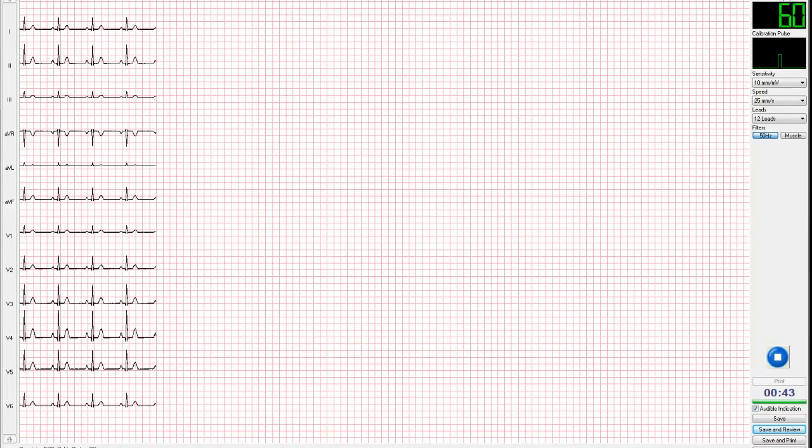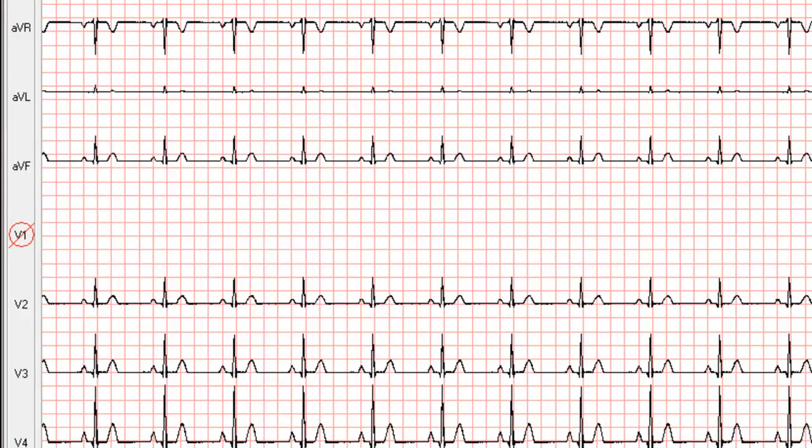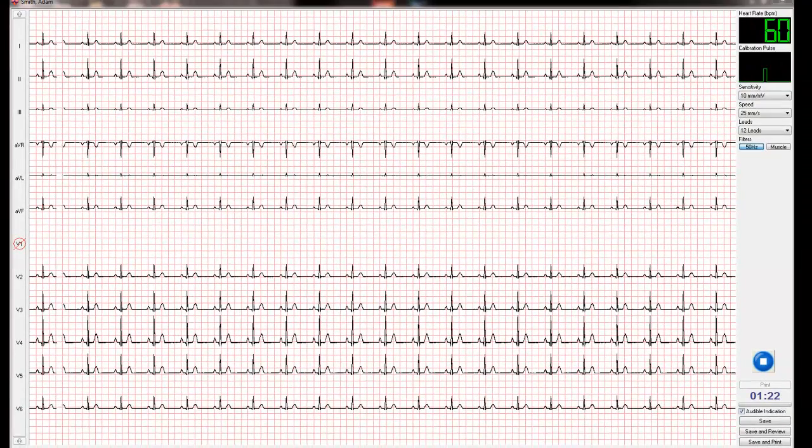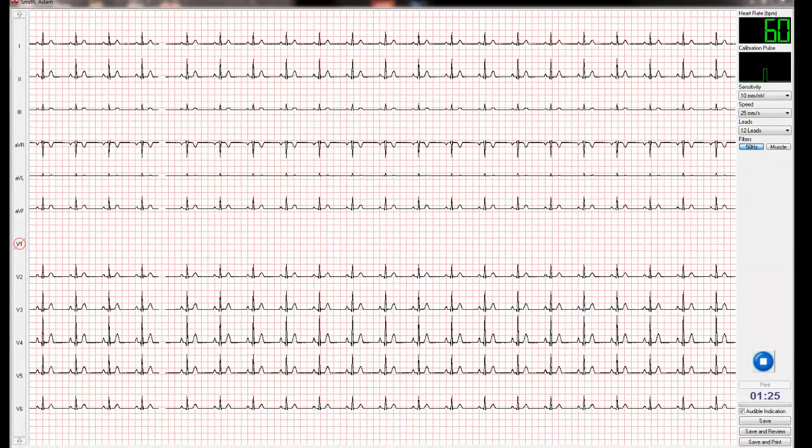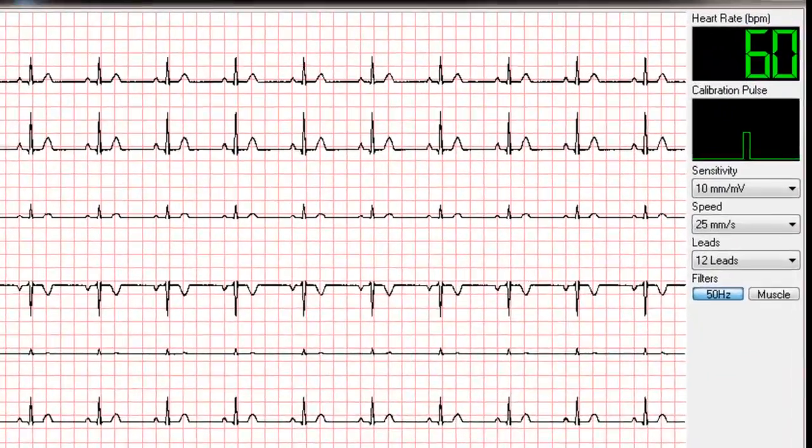If a lead wire is disconnected, the offending lead will be highlighted down the left-hand side of the screen with a red circle and a line through it, enabling you to resolve the issue without having to check each lead individually. The PC may also emit an audible indication.